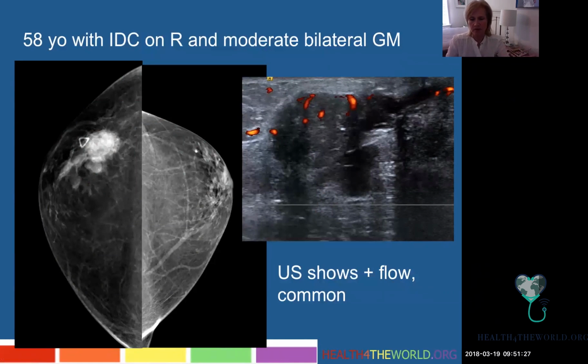When a man comes to us, it's usually because of a palpable mass, and we want to know, is he feeling all of this gynecomastia? Is it kind of a large, soft mass, or is it a small, harder lump like this, where there might be a cancer in addition to gynecomastia? And then we can confirm this sonographically. We see this hypoechoic mass with vascularity around it. We know we need to do a biopsy. These findings are suspicious, and we diagnose the cancer.